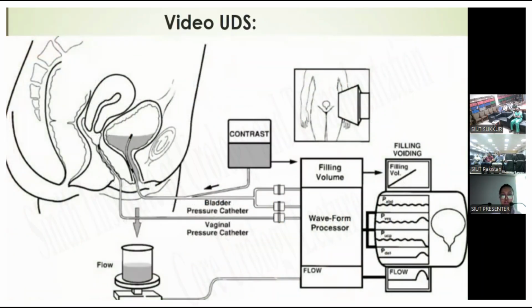This is the picture showing video UDS. The difference is this: in this we have fluoroscopy guided UDS.